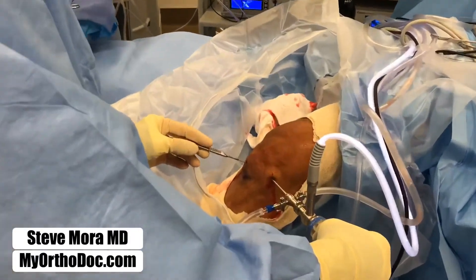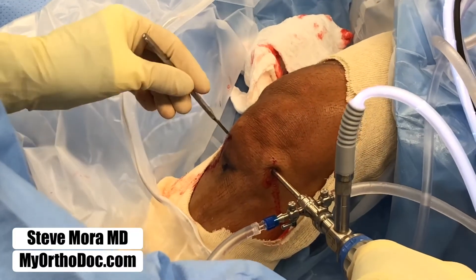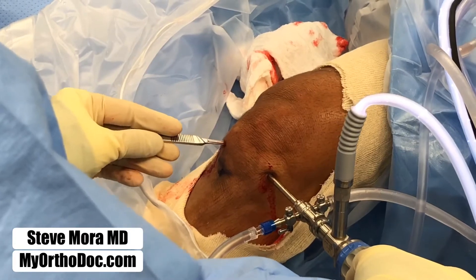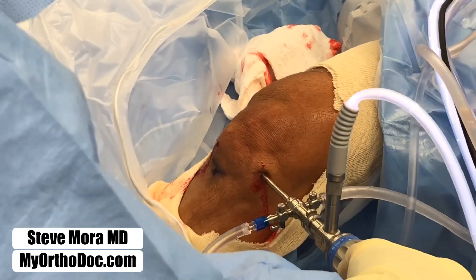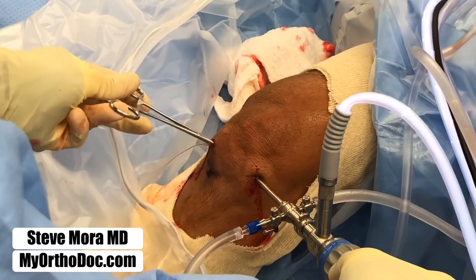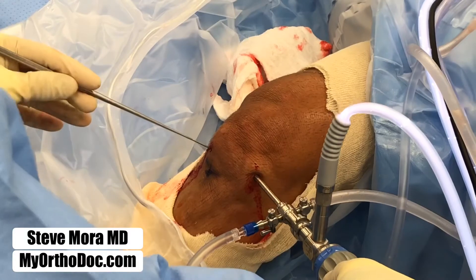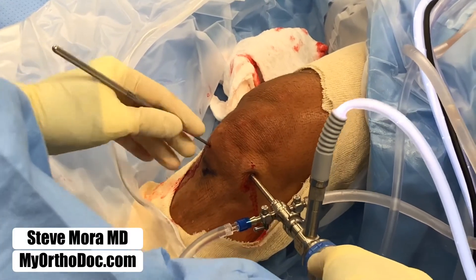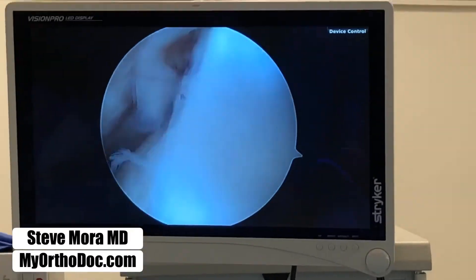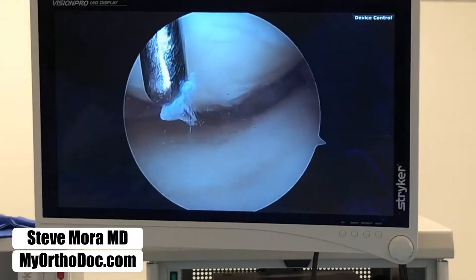I take my knife and open this portal up a little bit more. I don't aim down because I might hit the meniscus — I aim up. Open the portal slightly. Dilate the portal slightly with a clamp. Put a probe inside the portal. And then we look over there — let's see where we are. There is my probe.